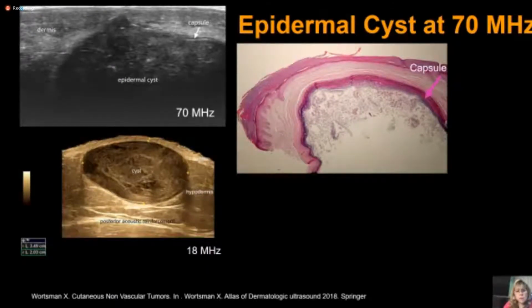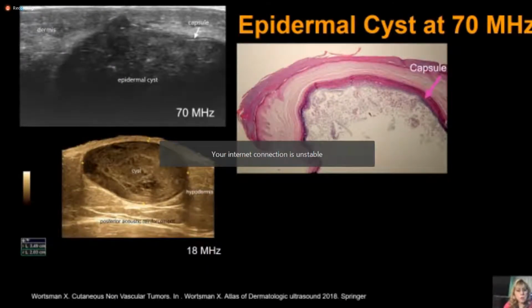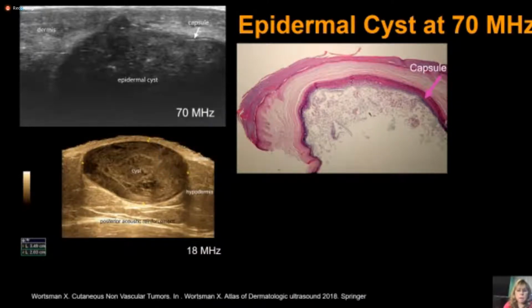The epidermal cyst has a capsule, and when the cyst becomes ruptured and these remnants of capsule remain in the tissues, the epidermal cyst has a high probability to reproduce.